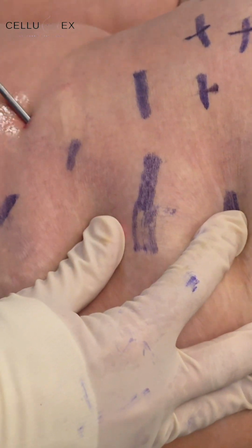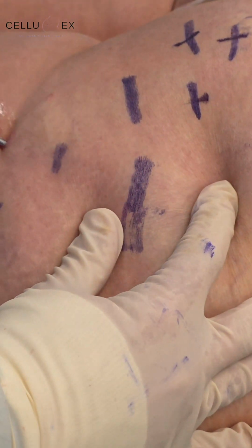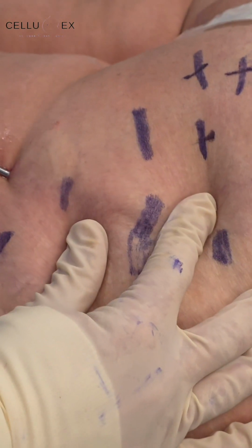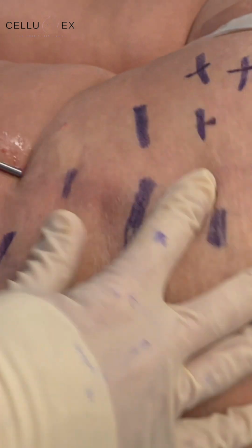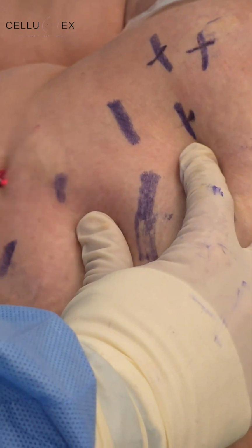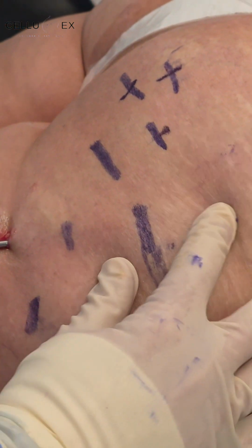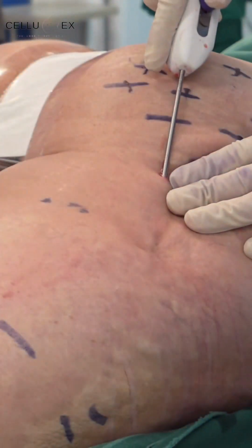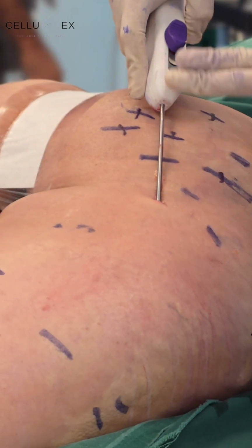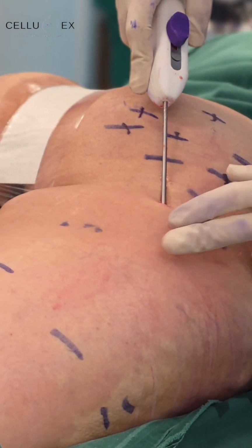We are treating the dimples. We are not treating skin laxity. The contraindications to using Celluex are skin laxity, for example, post-massive weight loss patients, or bulging fat, the same as in cases of lipedema. Always when you go, you have to go with the instrument parallel to the skin. Do not turn it around. Why? Because you don't want the blade to cut through the skin.